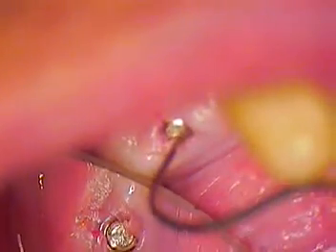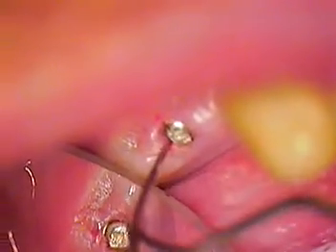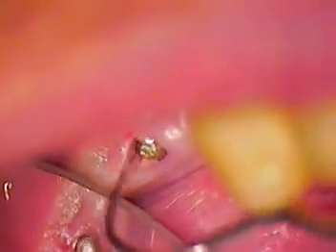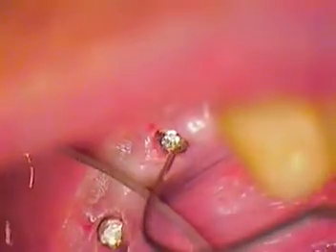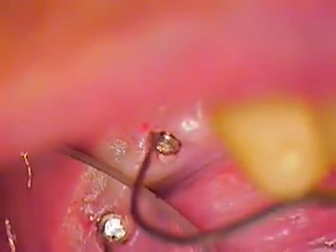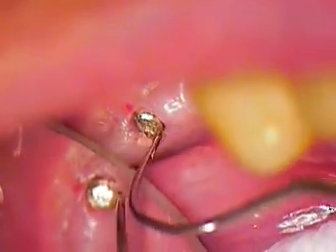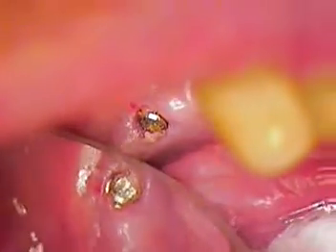That's how you do it. You get a microscope, you get a blunt instrument, and you don't panic. You just go in there and remove it. And talk to Darwin — he's moved from Attachments International to Implants Direct and he's doing a phenomenal job there. He's always bailing me out with not knowing what parts to get. He's right on with all the hard-to-find stuff, the antique stuff. So call Darwin — he's the go-to there, if you can get him. Sometimes he's really busy.